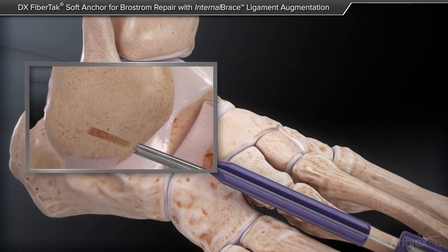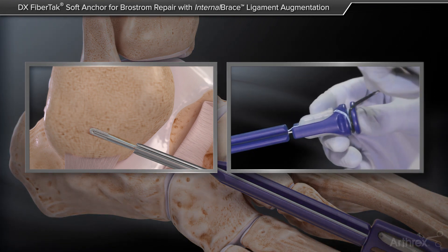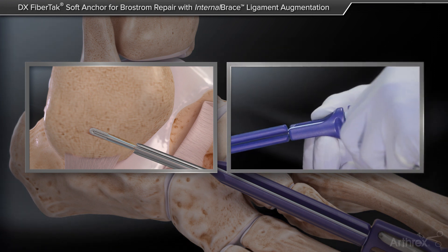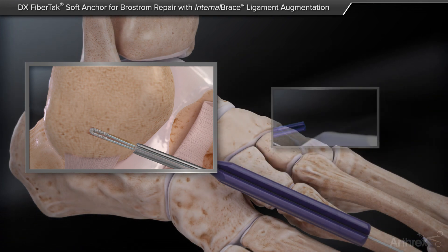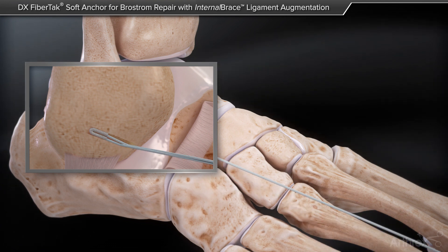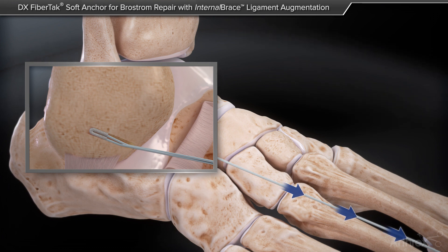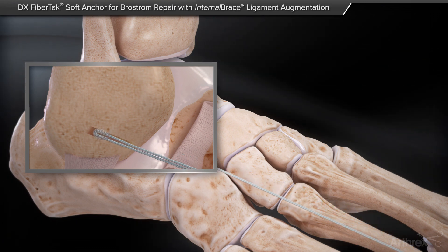Keeping the drill guide in place, the FibreTac anchor is inserted and impacted until the handle is flush with the drill guide. Remove the suture release tab, needle protector, and suture from the anchor body as shown. The open slot in the guide allows for easy removal of the sutures from the drill guide. After removal of the drill guide, the anchor is initially set in the bone by pulling back on the sutures, which firmly sets the anchor in the bone.